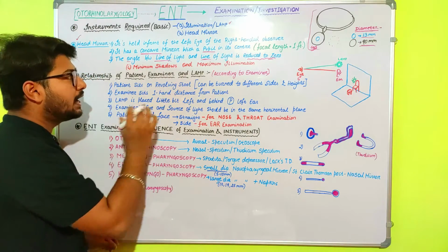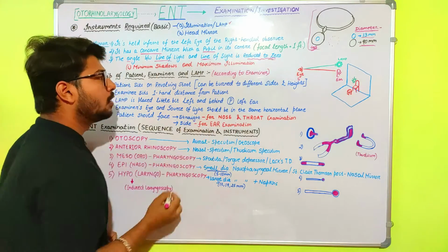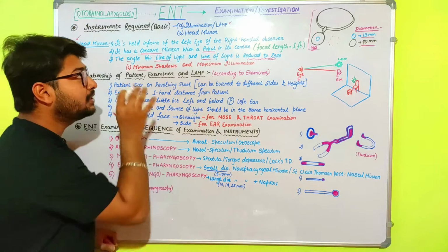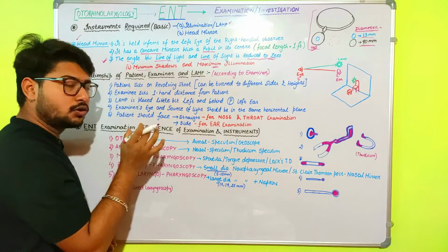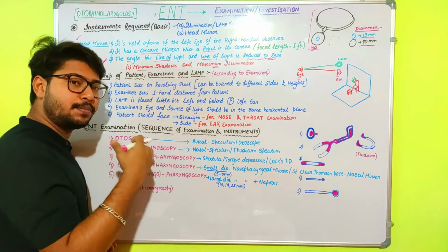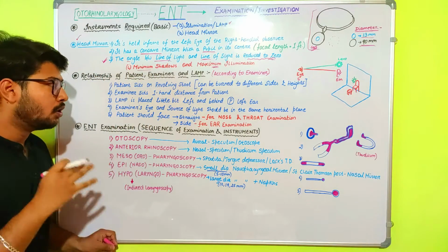Okay, and more specifically, why should this angle be reduced to zero? Because there will be minimum shadows inside the ENT organs and maximum illumination. By making this angle zero, we can have these two good effects for proper vision. That's why we require the angle to be zero.